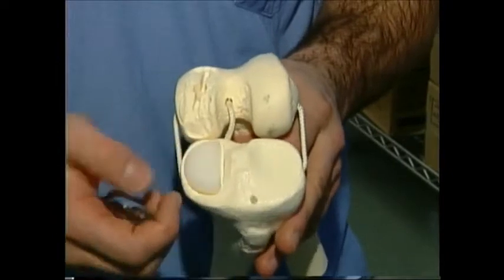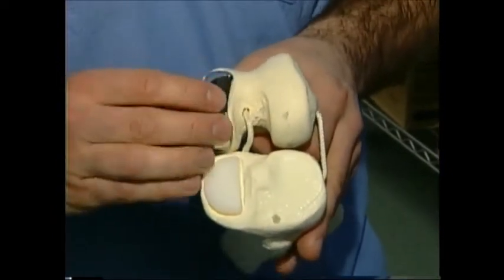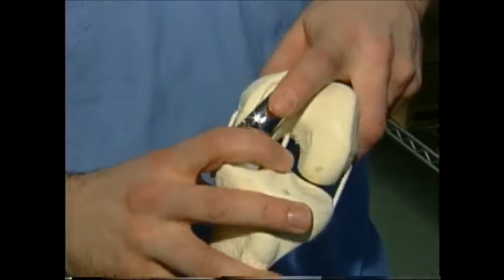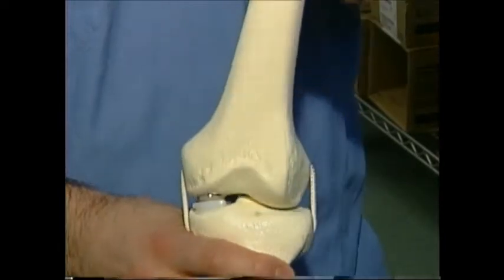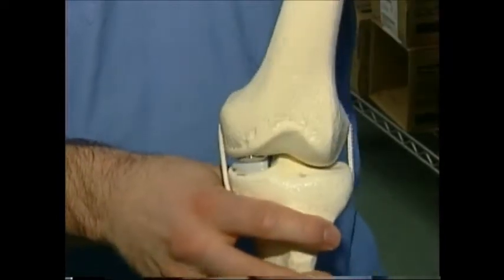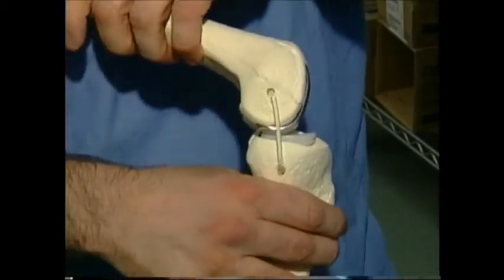We inset the plastic piece with cement. We do the corresponding procedure on the end of the thigh bone with cement. And then we've recreated a smooth, gliding, articulating region in the knee for flexion and for extension, which exceeds what's available now with current knee replacement technology.